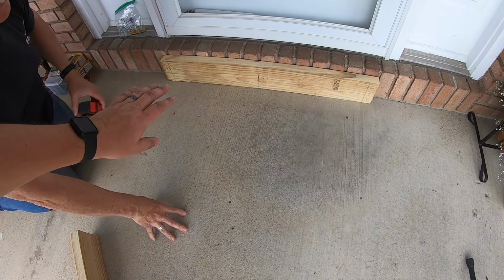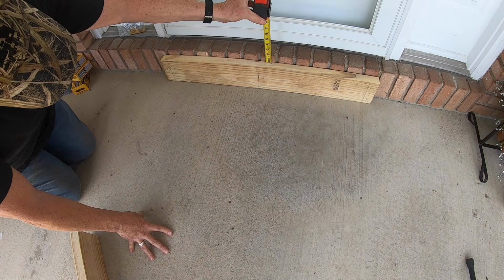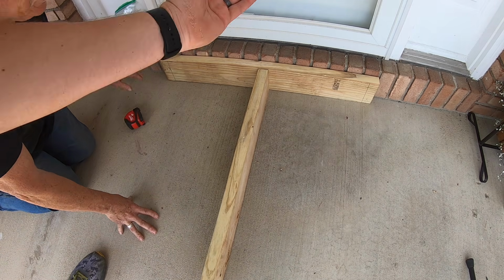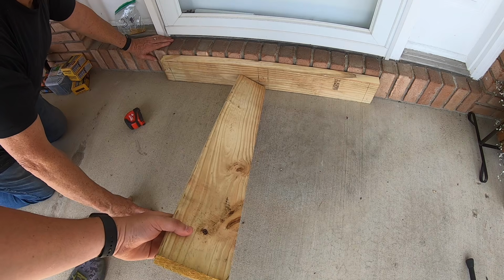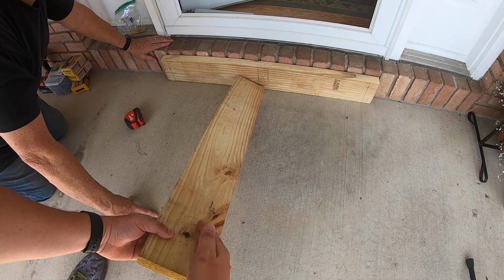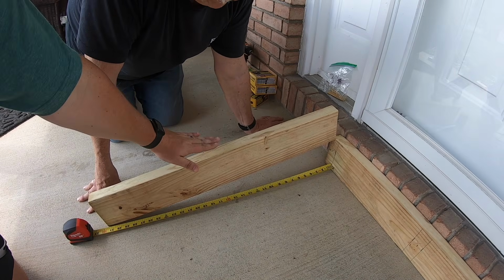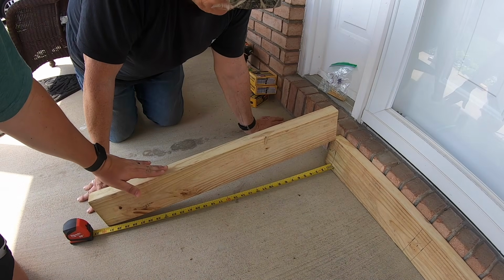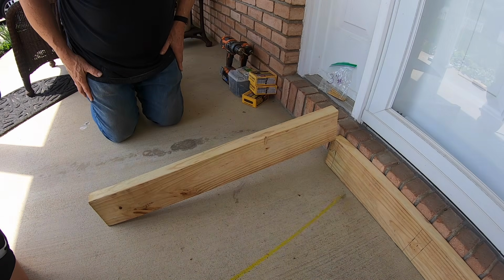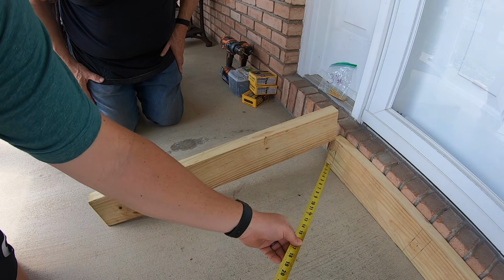So as you can tell, this is where the header is going to sit. Remember, that's the one we put the 3 different marks on. Then your runners are going to go here. Obviously, we're going to have to cut these at an angle. You cannot leave it all 6 foot, or else it'll just be a drop off at the end. So we are going to have to figure out the exact slope on that. So you're gonna go ahead and take one of your runners, just like this, and put it just on the edge there. And this will kind of give you this invisible line of the angle of what you are wanting to actually be able to cut out.